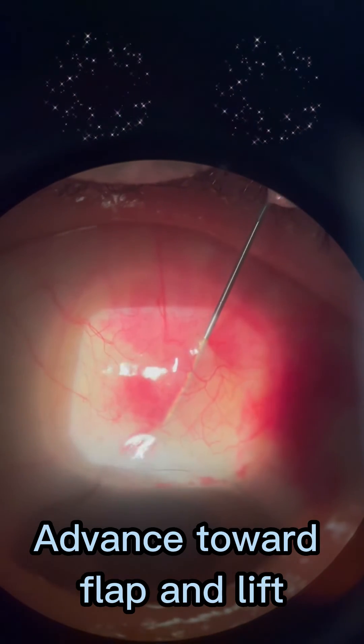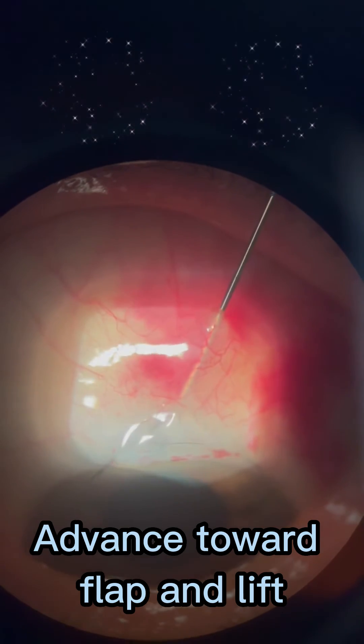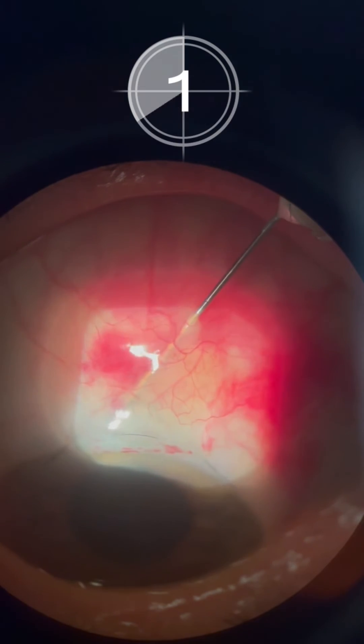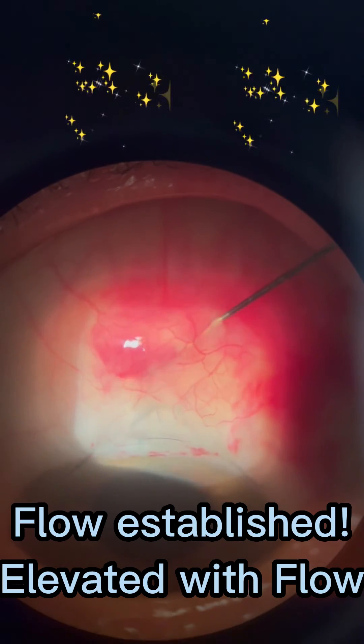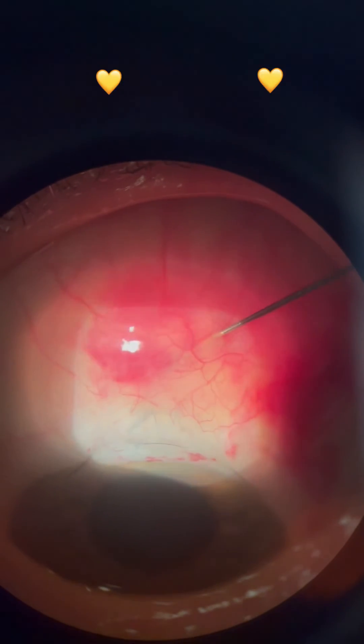I'm going to go towards the flap a little. Push forward a little. Going towards the flap. I'm just lifting the flap, sliding on the periphery as well.